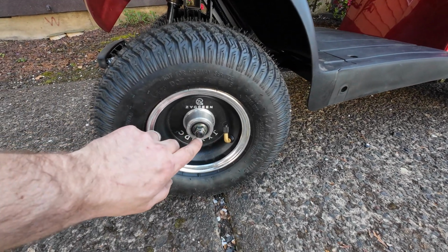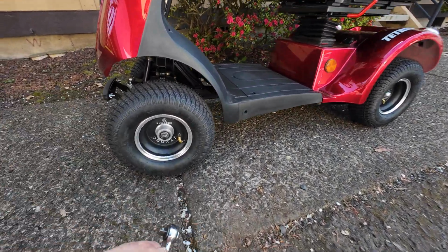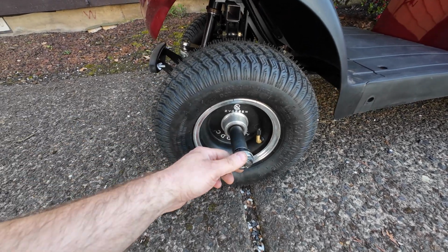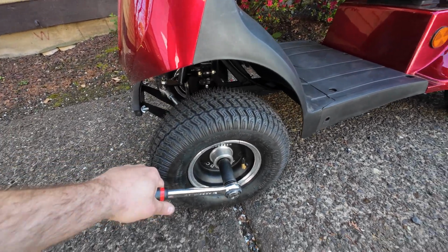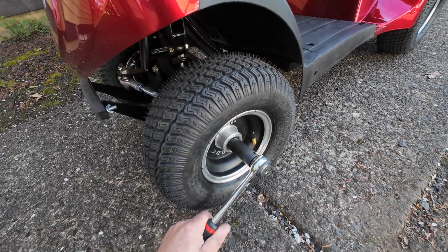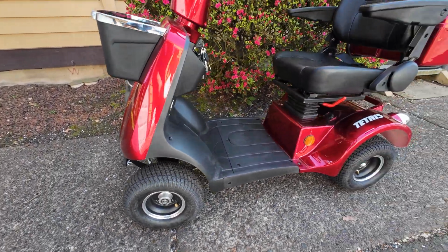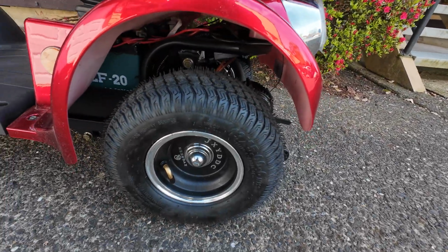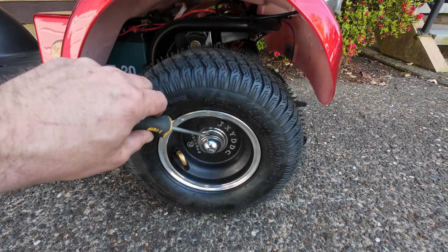Now there is a 19mm nut on the front, and my advice would be to break loose this nut while the scooter is still on the ground, because if you lift it up, it will not be that safe to loosen those nuts unless you have an impact tool. Because I'm showing this manual way with the ratchet, this is the best option. I'll do the same on the rear wheel, because I'm going to cover both wheels, how to remove both wheels, in one video.